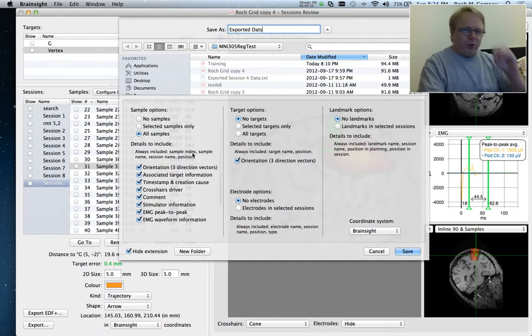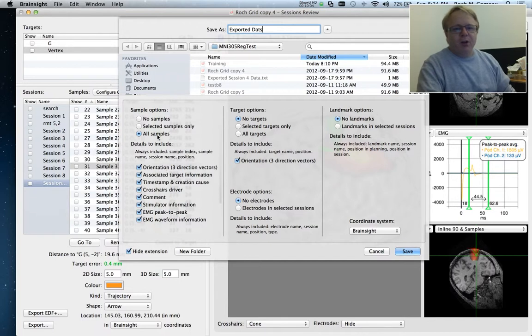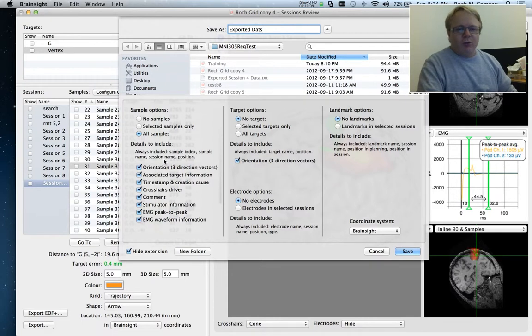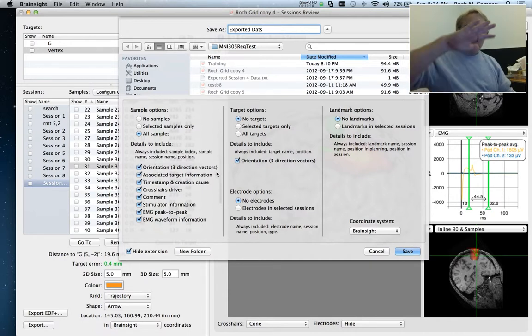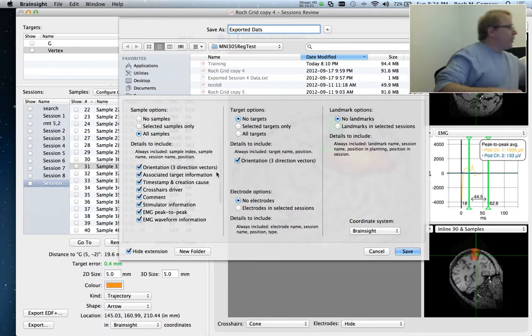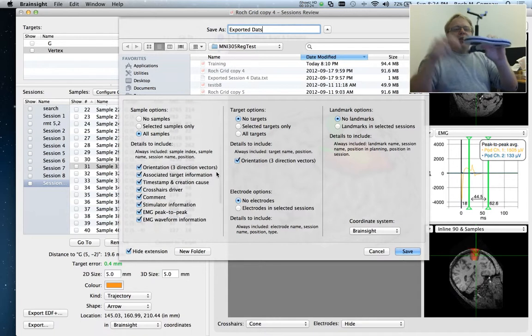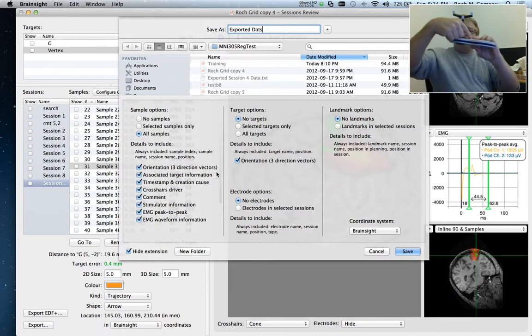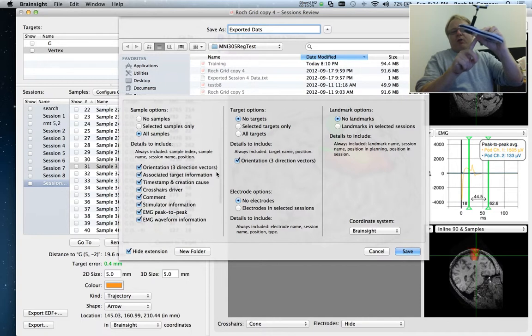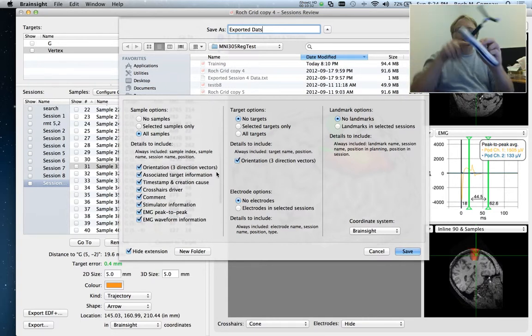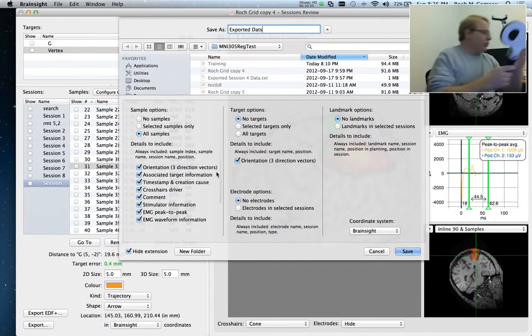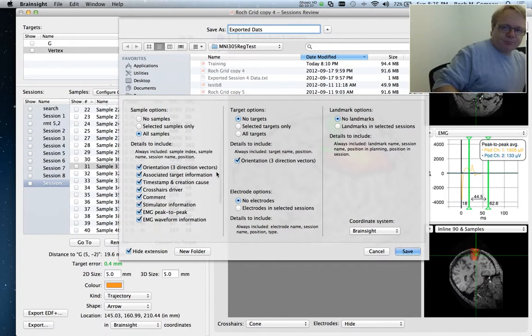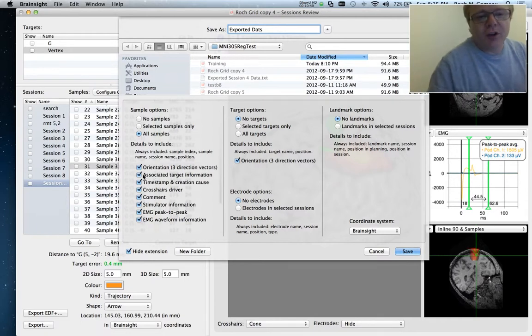So we always include the sample index. So first, second, third sample. The order in which they were acquired. The name of the sample, which of course you can change at any time. We also export the session name. So which TMS session that created the sample. And the XYZ position of the TMS coil. We can also export, selectively, the direction of cosine. So the three vectors of the TMS coil. So if you look at the coil, we can think of the X going from the middle, the hotspot to the right. Y from the hotspot forward. And Z from the hotspot up. So the Z vector gives you the orientation information.